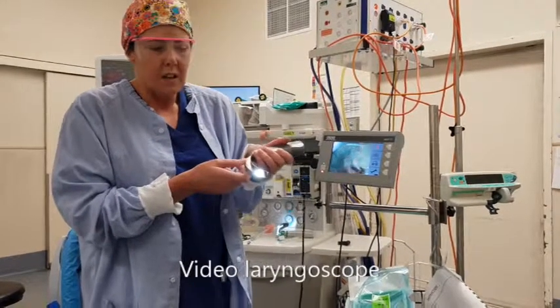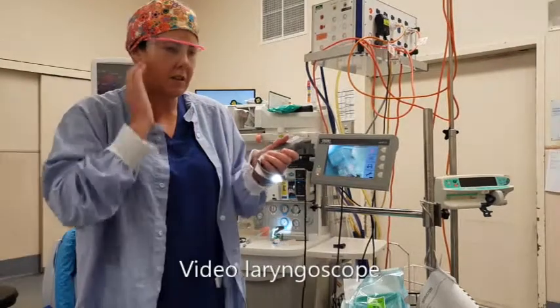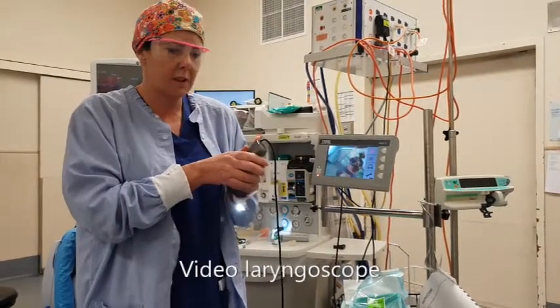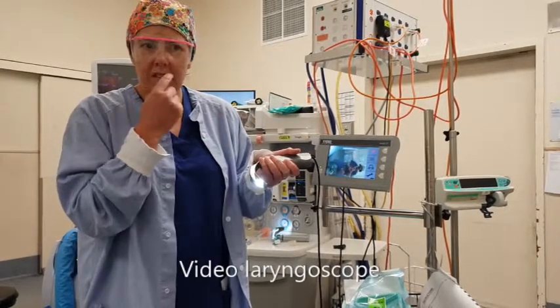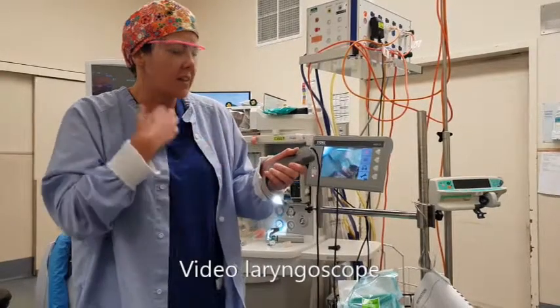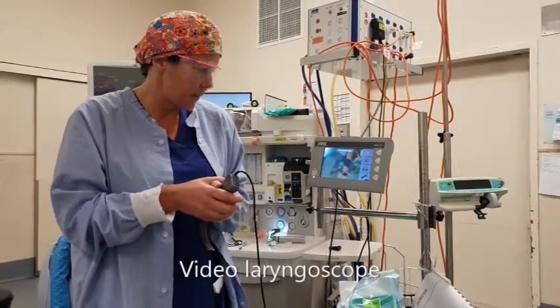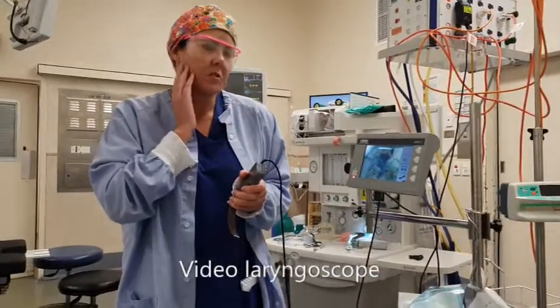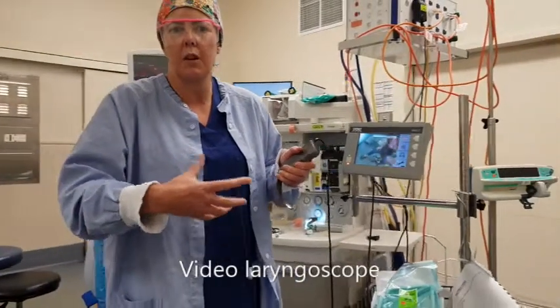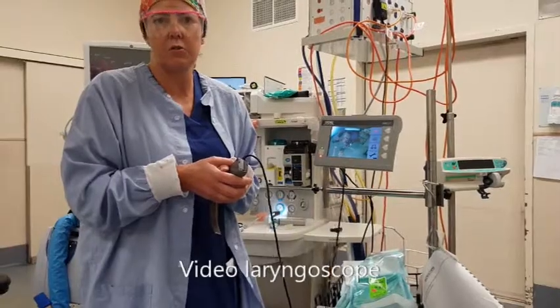We use the C-MAC for patients with very difficult airways, but also when a patient has neck issues where we don't want to hyperextend their neck at all — we can maintain the neck in a neutral position, which is really handy in some cases. We can also use it for patients with difficult dental work or abnormal dentition, because everyone can see what's happening and we can minimise dental damage. It's also useful for patients with obstructive sleep apnoea or larger patients, where we want everything on our side to get a good view and place the tube smoothly.